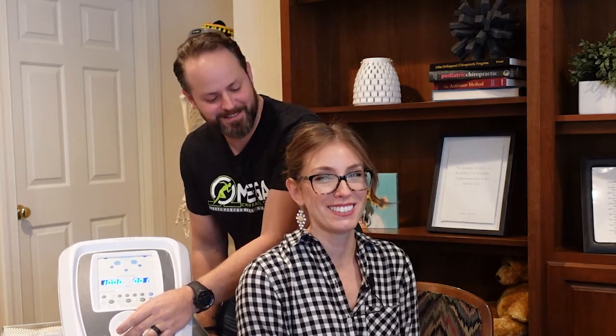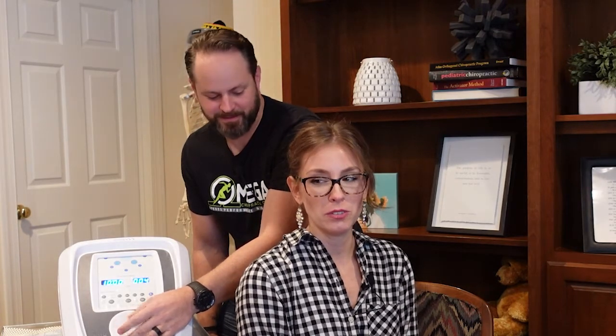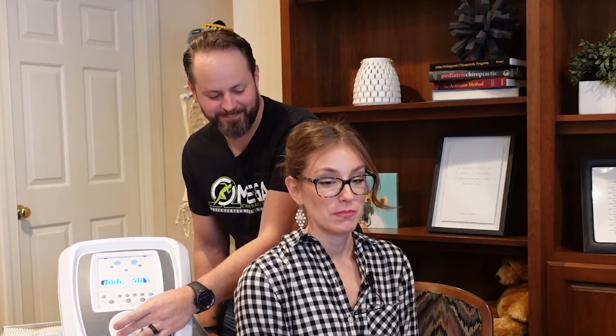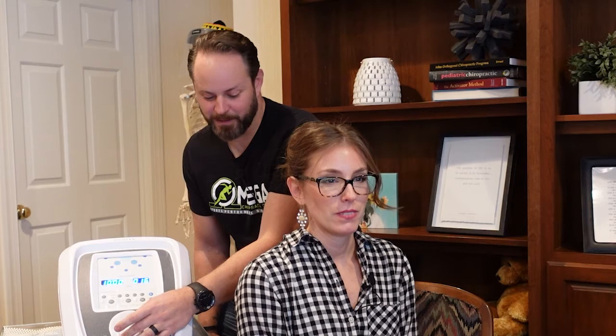Time to do that challenge, right? No. Come see. You want to see how I can? Try. This is payback for all that stuff you. What? I do nothing to you but love you. I love you too, with electricity. Do you feel it yet? No. Not yet. I don't know that he knows how to work. This isn't my machine. All right. Tell me when. I'm keeping going. You can stop now. Okay.